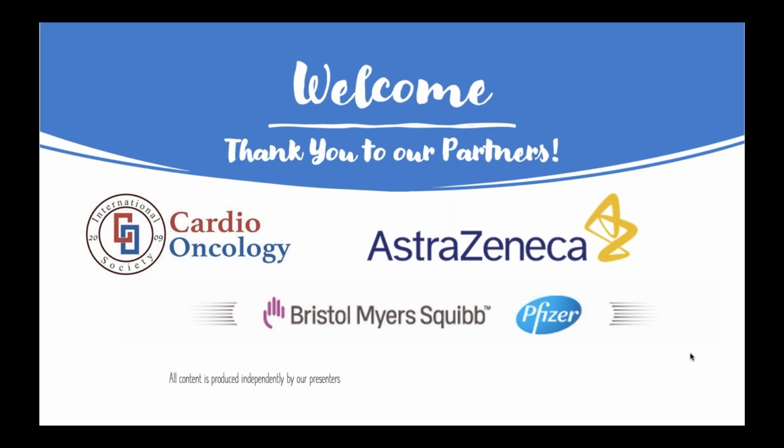Thank you. Okay, I can answer first of all for the time commitment. If you were to use feature tracking CMR, you only need the cine images of the CMR, so the short axis stack, and also the apical 4-chamber and 2-chamber. And this would be post-processing assessment of your strain. It will be the same thing as the echo, where you take the 4-chamber, the 3-chamber, and the 2-chamber, and you perform post-processing.